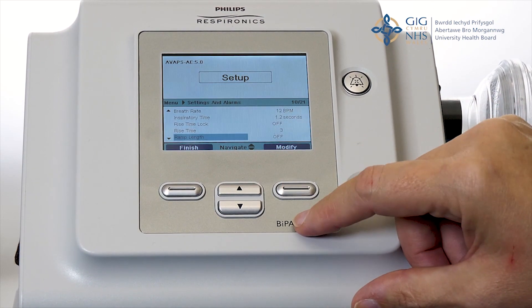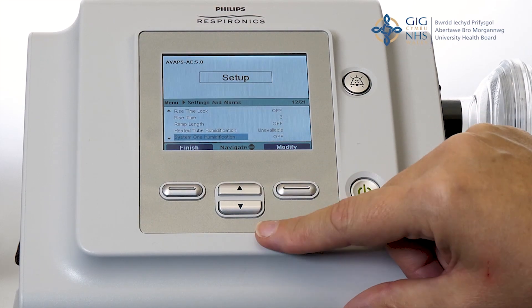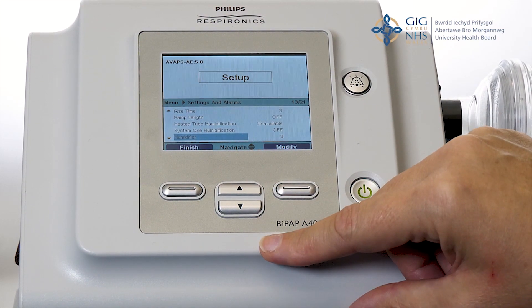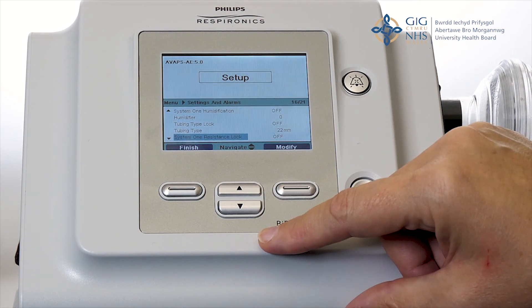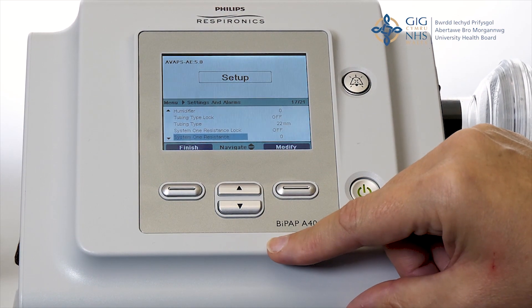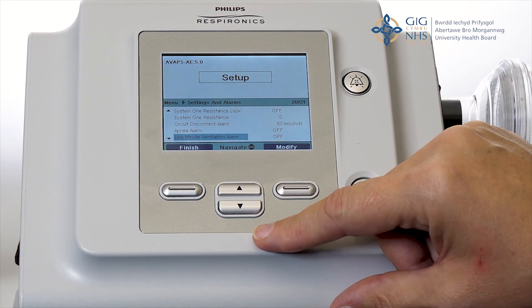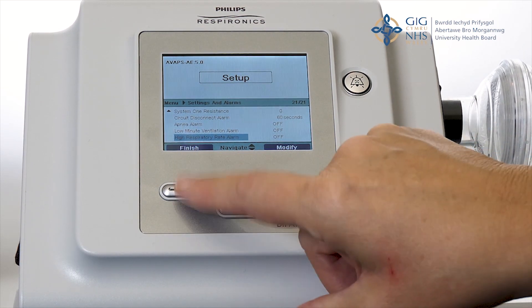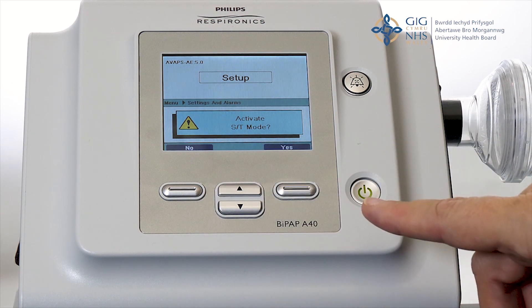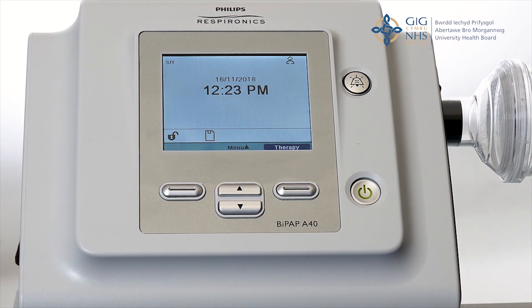Rise time 3. Ramp length off. The heated tube humidification unavailable. System 1 humidification off. Humidifier 0. Tubing type lock off. Tubing type 22 millimeters. System 1 resistance lock off. System 1 resistance 0. Circuit disconnect 60 seconds. Apnea alarm off. Low minute ventilation alarm off. High respiratory rate alarm off. Then press finish and then activate the ST mode. Press yes and then press exit and then the machine is set up and ready to deliver therapy.